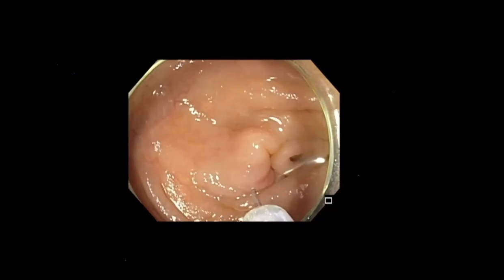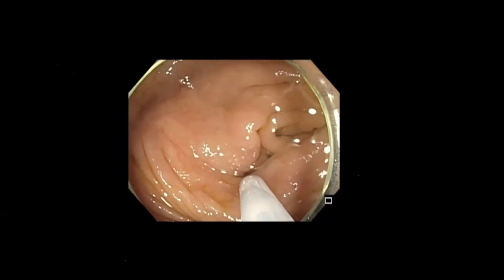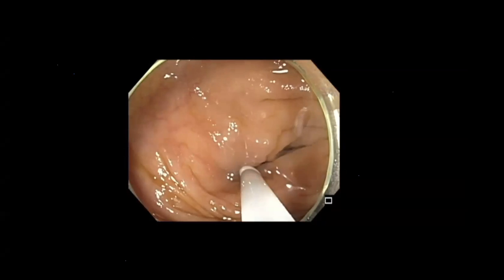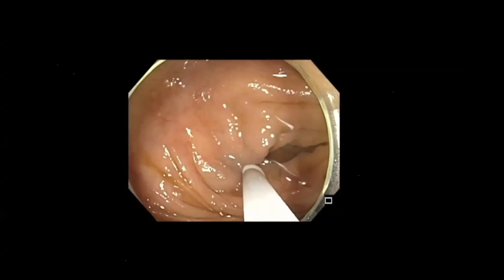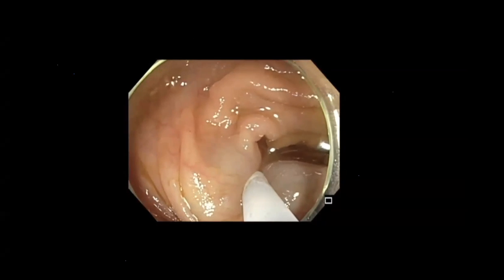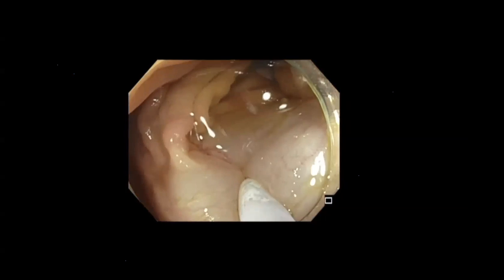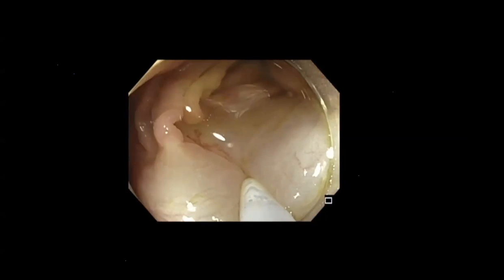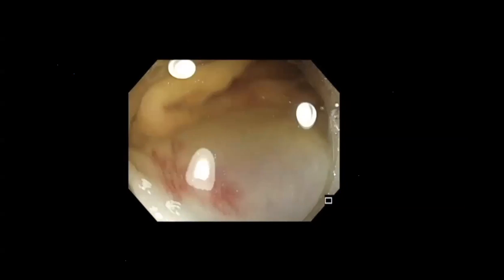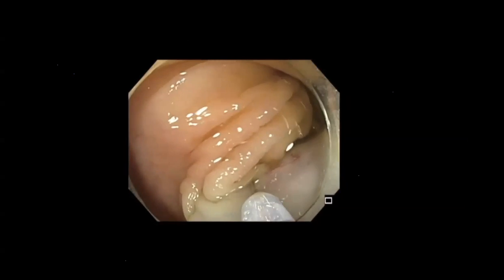So we decided to inject, and based on some of the literature, I use saline with a little bit of epinephrine. The dilution is about 1 in 100,000. And one thing I want to share with you is this was not an easy colonoscopy. I had to struggle because of her scoliosis, and the colon was not easy to reach to the cecum. And I thought that, okay, I need to take every precaution in her case.